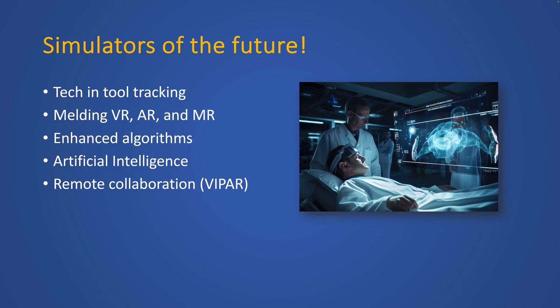VR immerses users entirely in a virtual world using head-mounted displays, controllers, and sensors. AR enhances real-world experiences by overlaying real-time information on portable wearable devices, while MR combines elements of both, enabling users to interact with virtual objects in the real world.